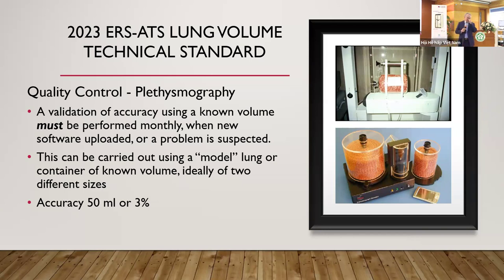Và mình thấy rằng do trước đây khuyến cáo cho nên là không ai làm hết đó. Cái nhà sản xuất cũng không sản xuất cái mô hình này. Nhưng mà hiện giờ mình đã có khuyến cáo, thì những cái máy mới thì có lẽ là khi mà bán cái máy phải đăng ký thì cái nhà sản xuất sẽ phải bán theo cái mô hình này để mà mình định chuẩn. Còn cái máy mình hiện tại chưa có. Nếu mà chưa có thì chắc là mình đã lỡ mua rồi, chưa có thì thôi mình cứ chờ.